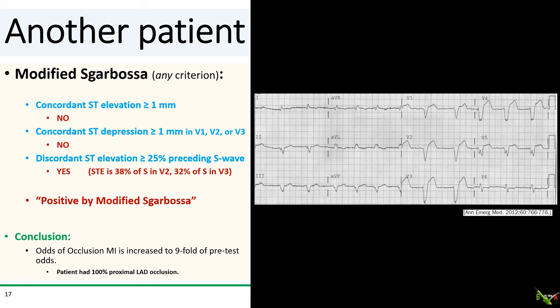Using the modified Sgarbossa criteria, however, the patient has pretty sizable discordant ST elevation in V2 and V3 compared to the S wave. In V2, the height of the ST elevation is 38% the size of the S wave, and in V3 it is 32%. This means the patient is positive by the modified Sgarbossa criteria, meaning his odds of having a STEMI equivalent occlusion MI is ninefold higher. This patient ended up going to the cath lab emergently and had a 100% occlusion of the proximal LAD.